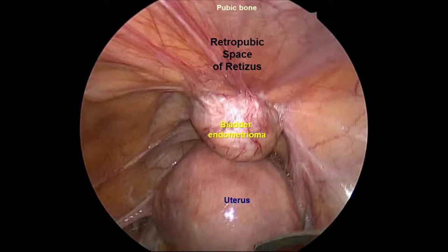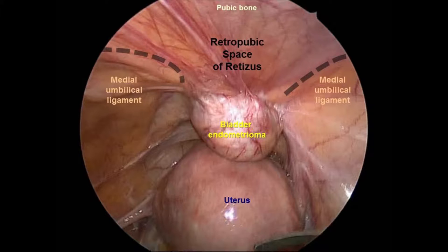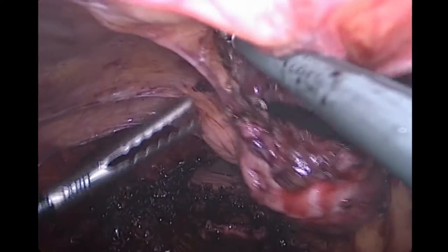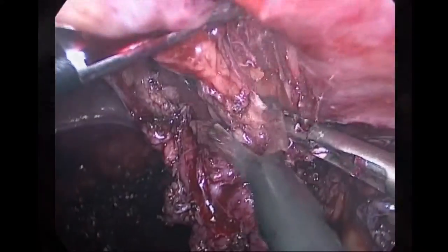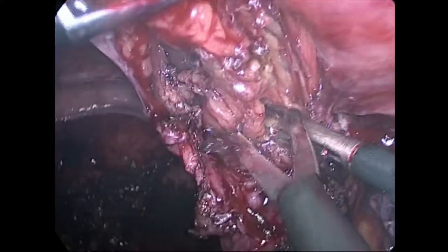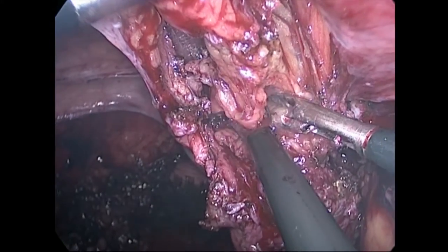The retropubic space of Retzius lies between the pubic bone and bladder. The retropubic space is bordered posteriorly by the urethra and pubourethral ligaments. The space is entered by incising the peritoneum medial to the medial umbilical ligament by pulling the ligaments for counter-traction. The bladder can be retrograde filled with air or fluid to help delineate its borders during this dissection. Dissection close to the pubic bone should be avoided in order to prevent injury to the midline dorsal clitoral neurovascular bundle.